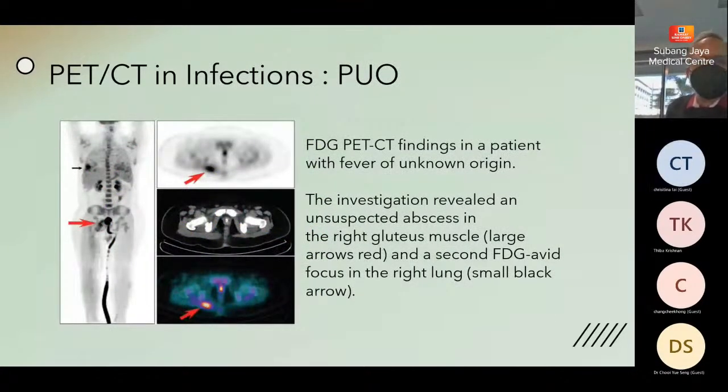Right. Another thing for FDG PET. When I was in UH last time, one of the main usages of gamma scans or white cell blood studies was to look for fever of unknown origin to find out any localized site. But white blood cell studies are very difficult. Technically, it's very challenging, and there's a lot of false positives and false negatives. But with FDG, things are easier. It's actually cheaper than using our normal type of scans.